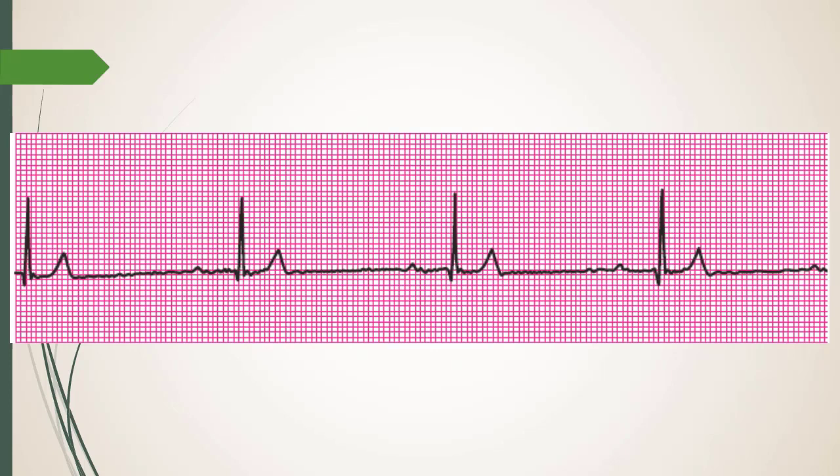This next strip shows a P wave, QRS, a small Q, and a T wave with a slow rate. It looks like a sinus rhythm. How many complexes are in the six-second strip? Remember, you only count a complex if the whole thing is within the strip.